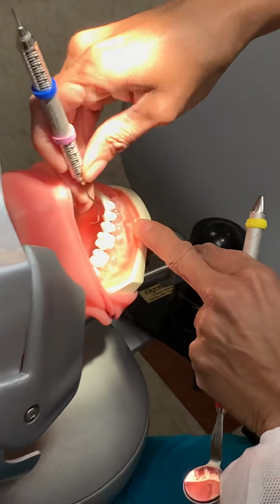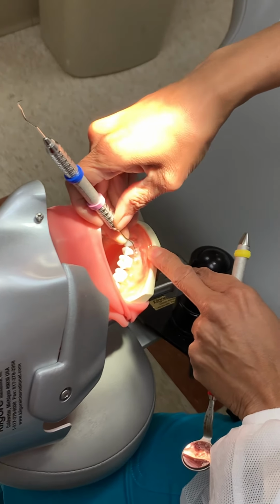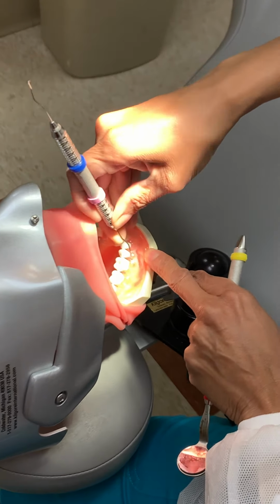So terminal shank here. We start at the distal line angle, and Ms. Grooms talked to you the other day about the different motions. We have a finger motion, and then we have a wrist rocking motion. We use the wrist rocking motion. We never use the finger because you can start having problems with your finger. The wrist rocking motion is where your wrist is rocking like this. She used a term yesterday about rocking off of your fulcrum. So this is what she meant when she talked about rocking off your fulcrum.